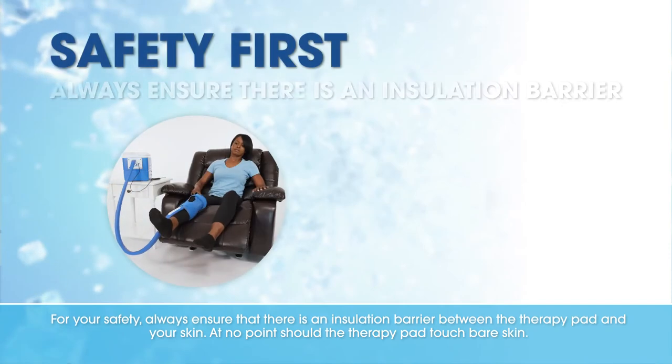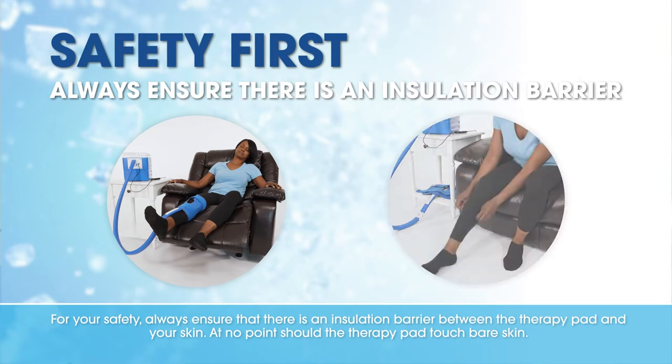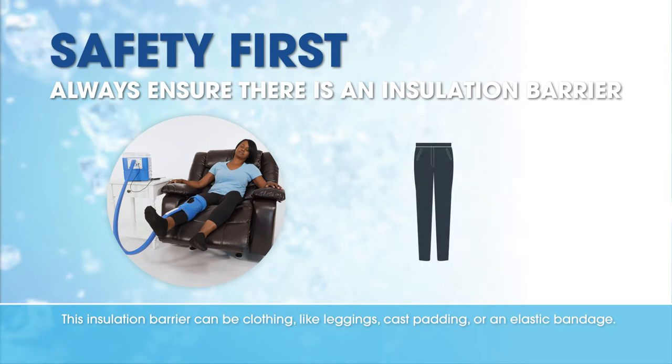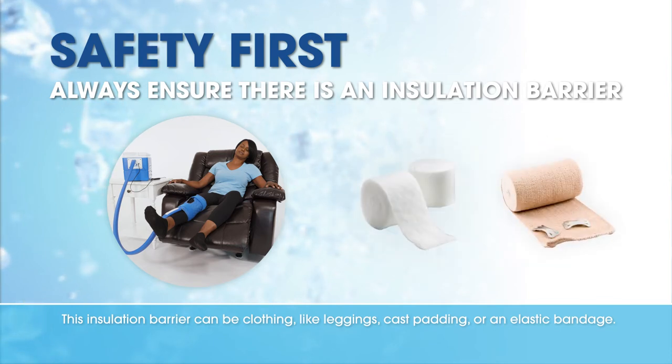For your safety, always ensure there is an insulation barrier between the therapy pad and your skin. At no point should the therapy pad touch bare skin. This insulation barrier can be clothing like leggings, cast padding, or an elastic bandage.